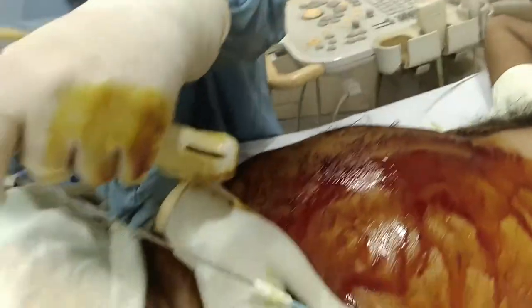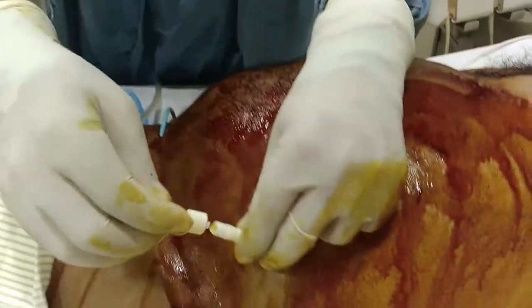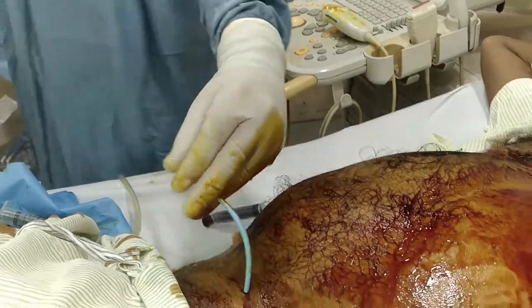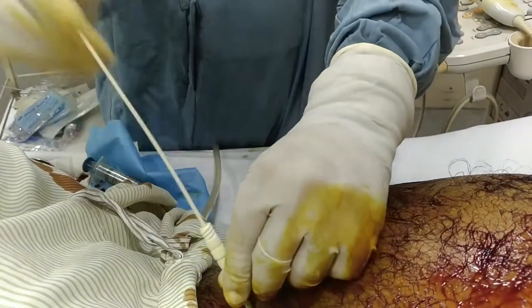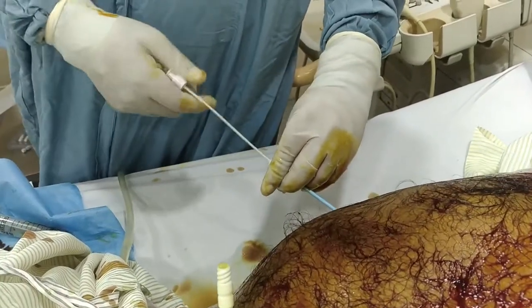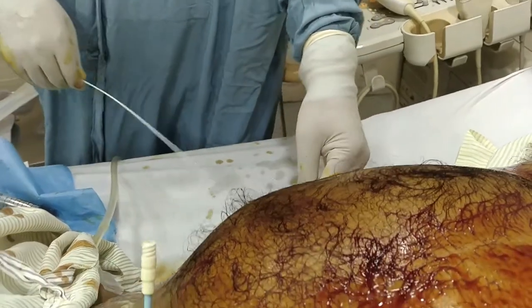Now we put it in like this. See how it's coming in. The tip was showing some resistance, so what we'll do is take a metal stylet and a plastic stylet and try to push it a little bit more so that the bad stuff also comes out. Look at this — look at the drainage, yes.